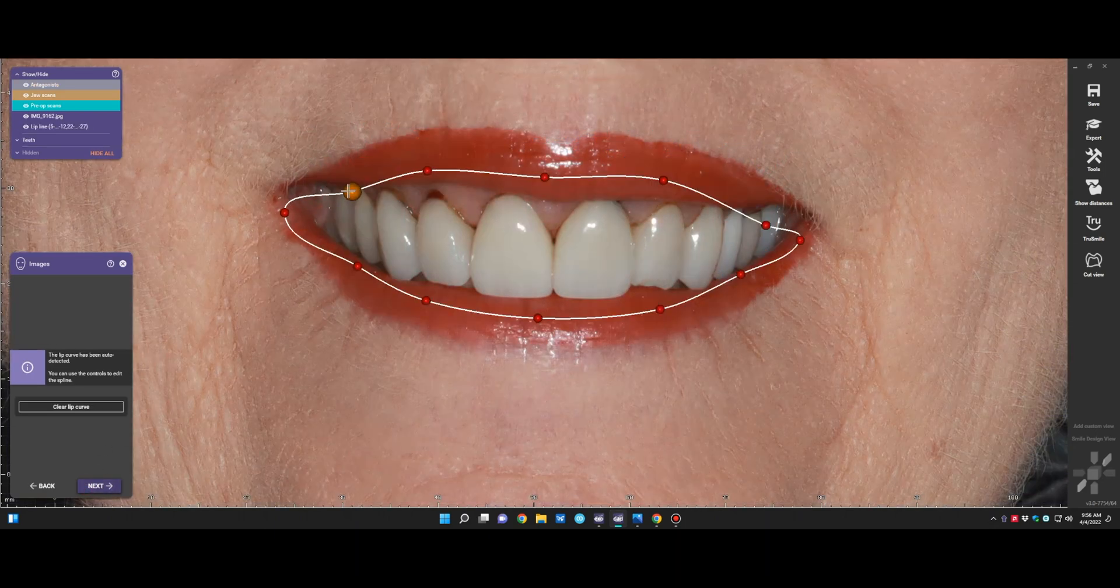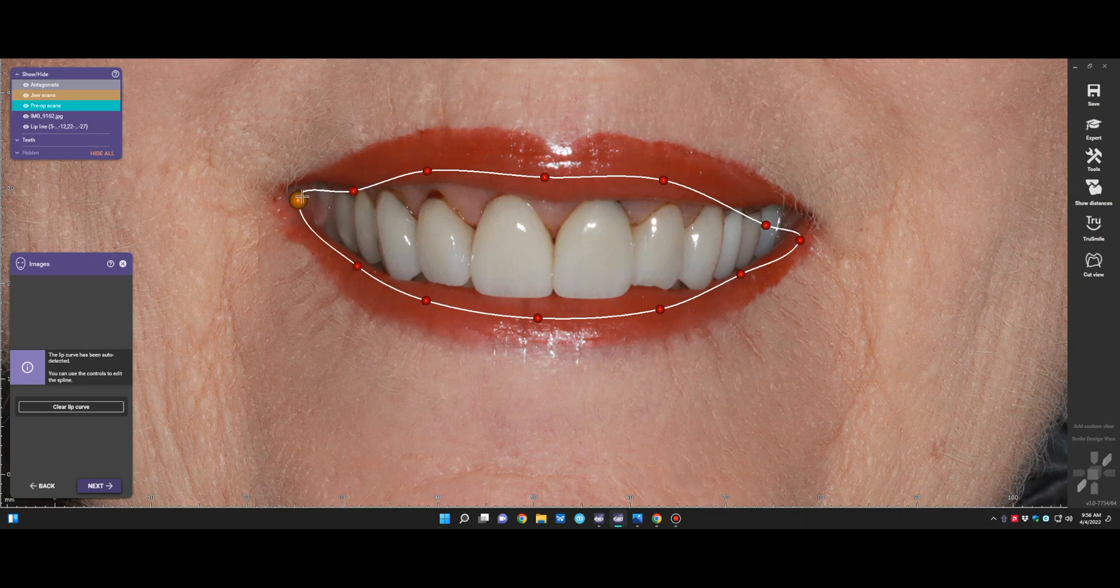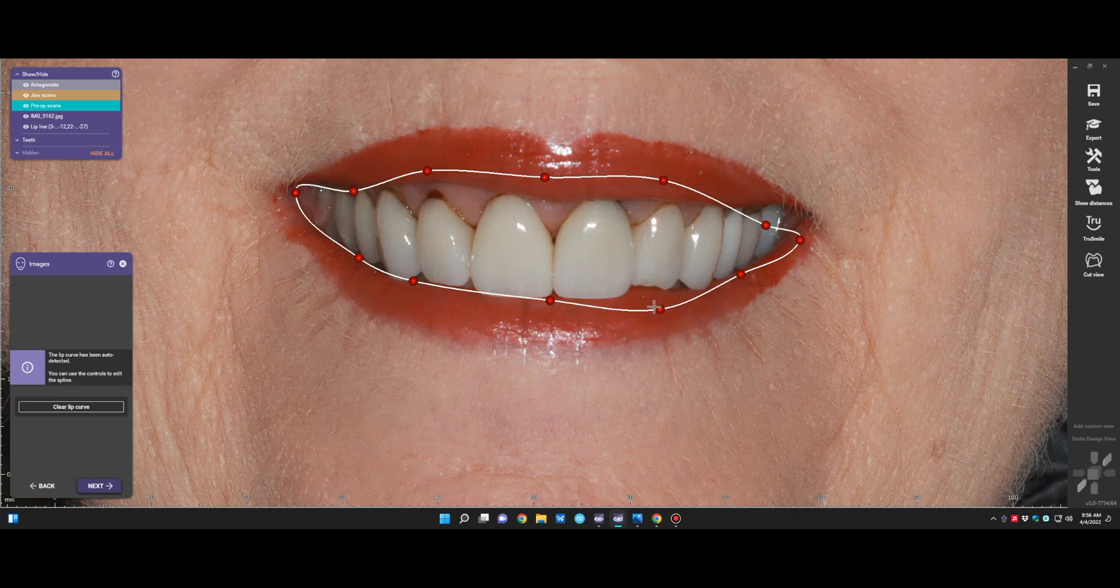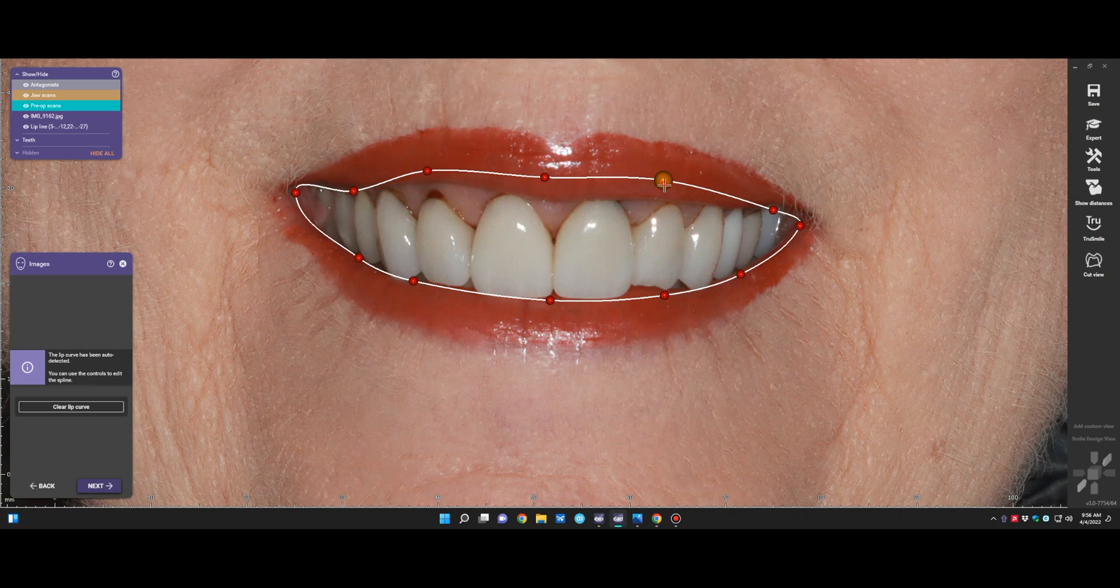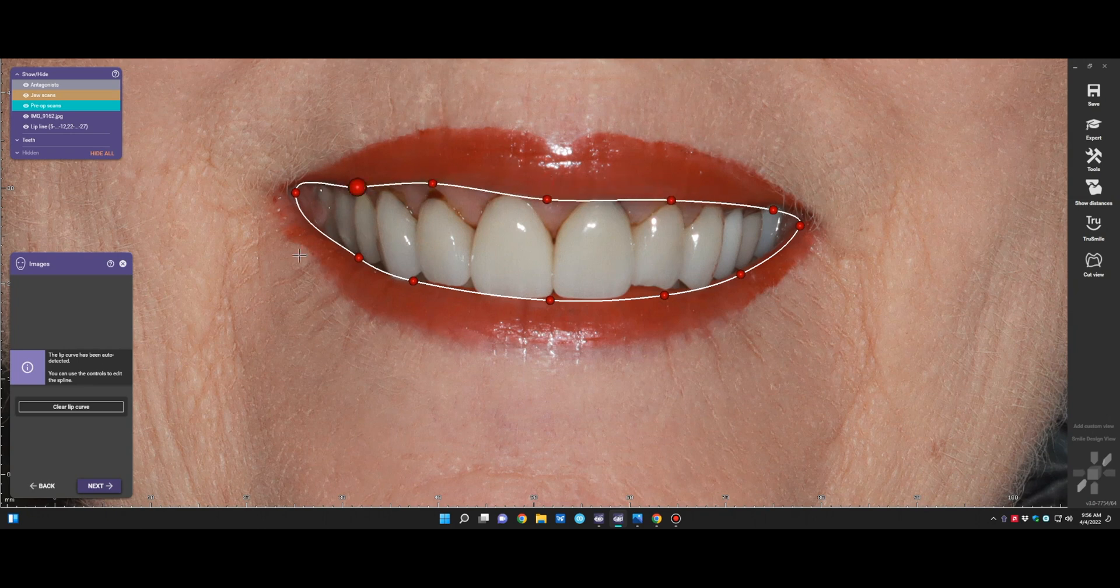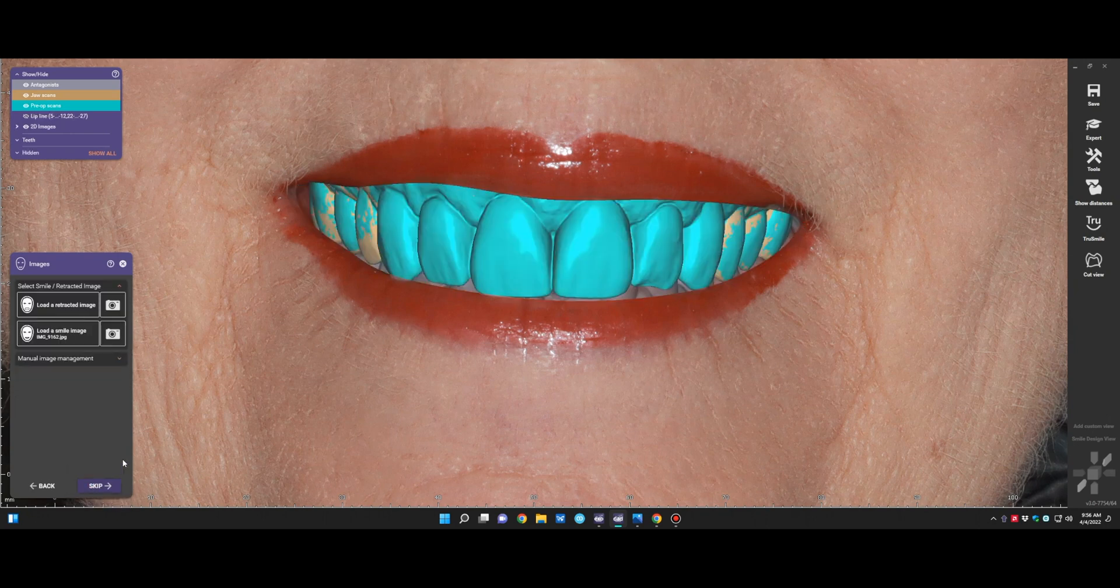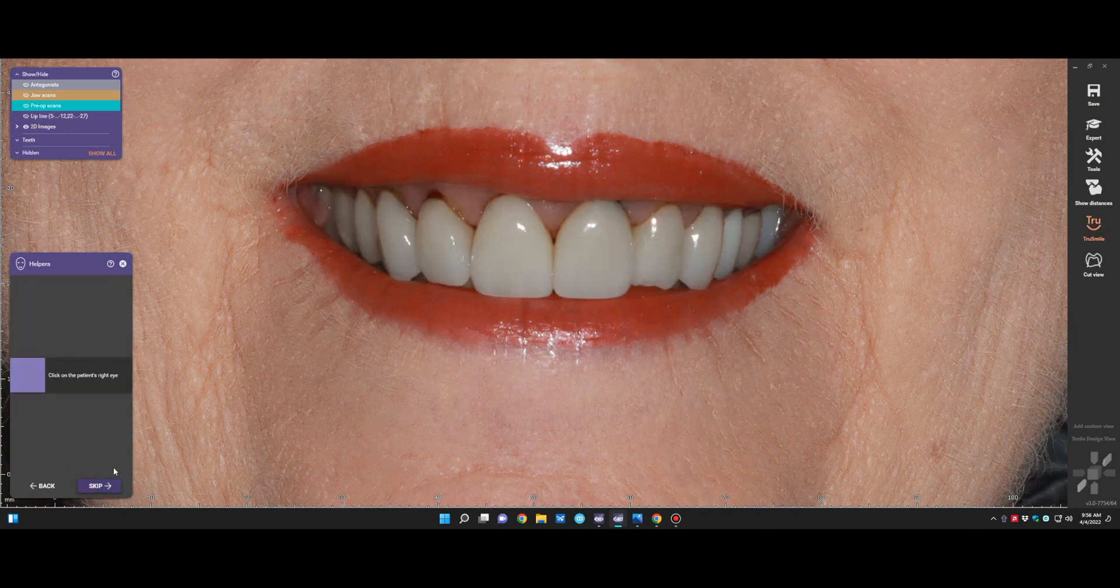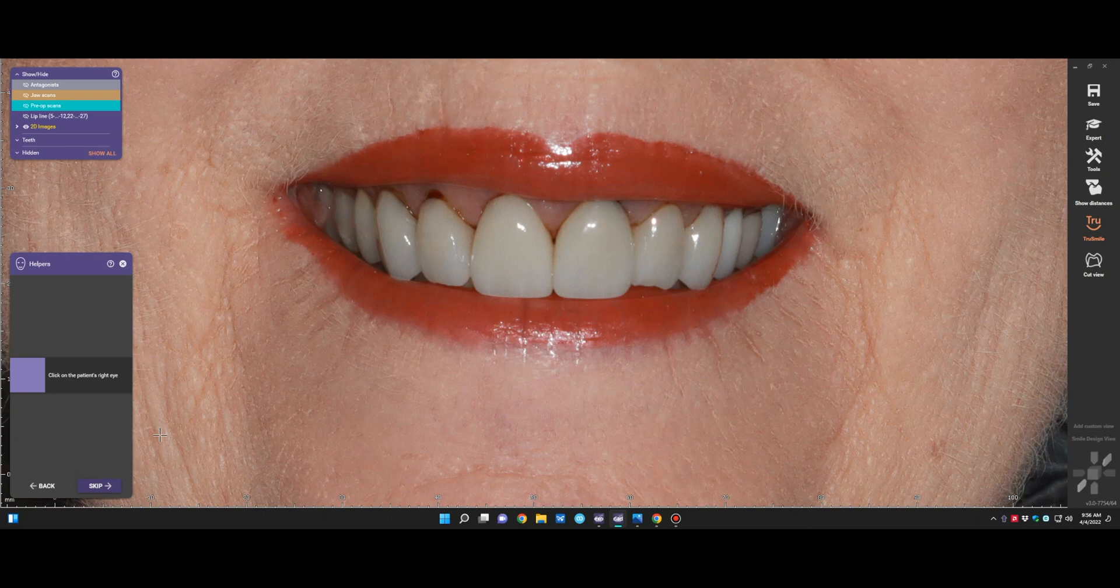Now we'll outline the lips. You can start from scratch. You can eliminate these markers and just draw it yourself. Or you can just move the ones that it designates for you to the right position. Once you feel like you've outlined the lip, then you'll go next. And it'll cut that out. So you can see that the 3D images behind the lips.